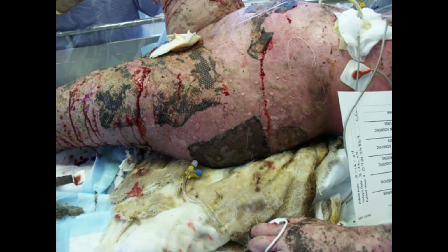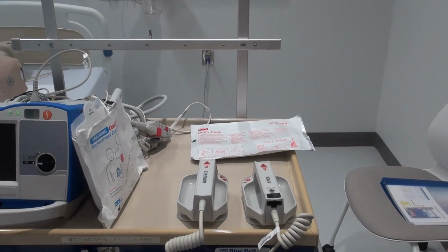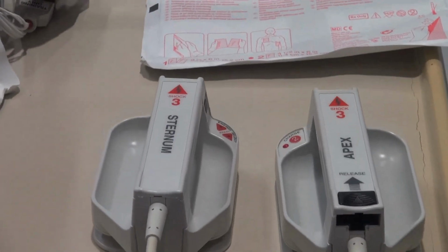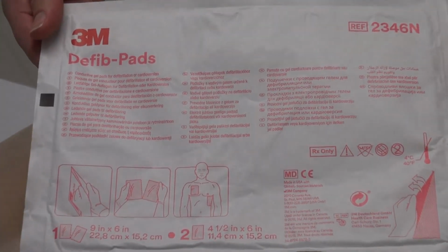Patients with burns to the chest and/or back where the adhesive pads would be placed should instead be defibrillated or cardioverted using paddles. Please note that paddles cannot be used to transcutaneously pace. Each paddle is labeled with the anatomical location on which it should be placed. One is placed over the apex of the heart and one at the second intercostal space along the right sternal border. Gel pads are required to be placed between the paddles and the patient.